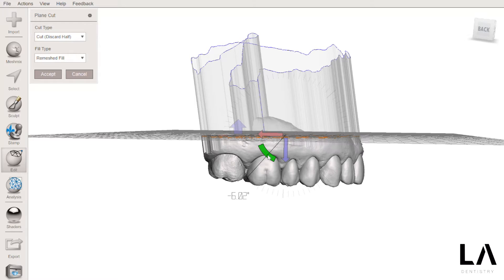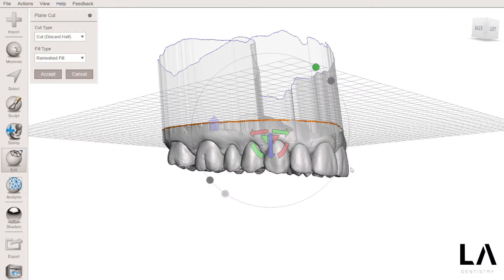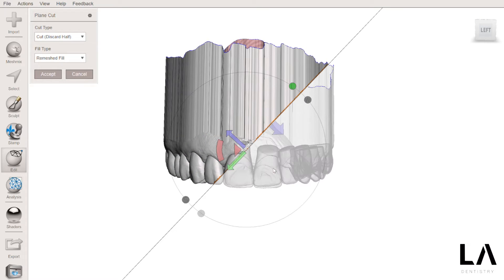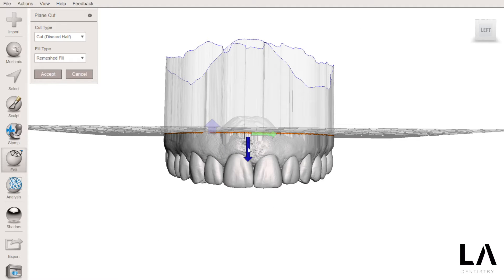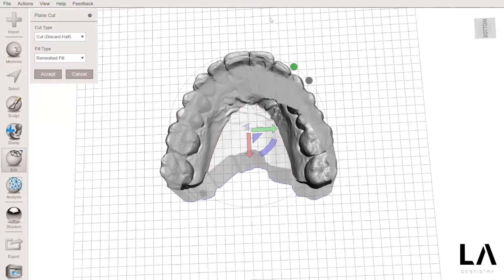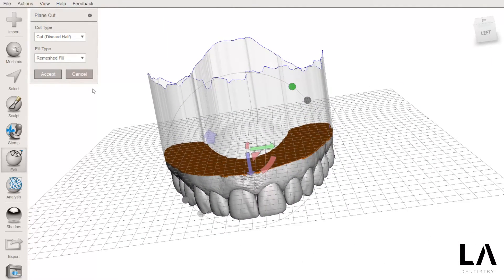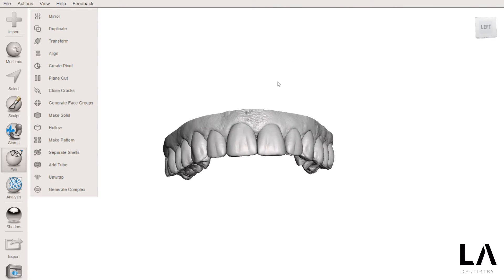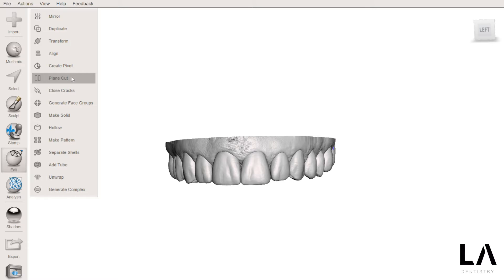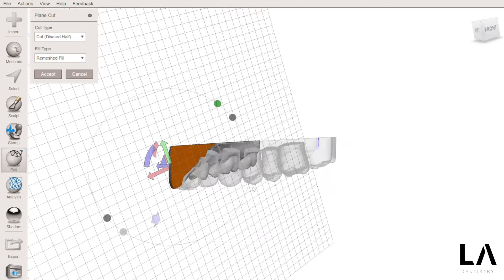I'm just going to adjust the orientation of this plane a little bit more. It looks better — maybe I can cut a little bit more. Now it looks okay and I can accept. So now I have my model, but if I go to Plain Cut again, as you can see, my model is completely filled — it's completely solid.